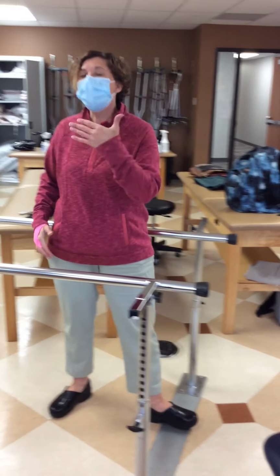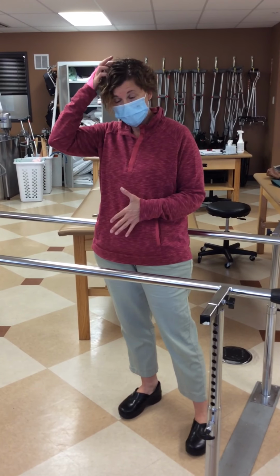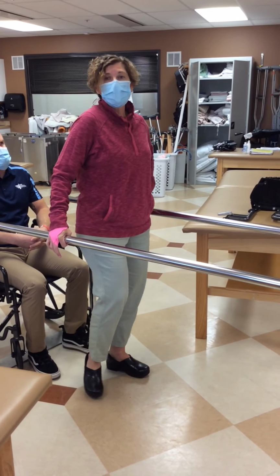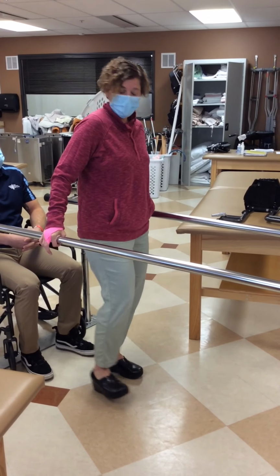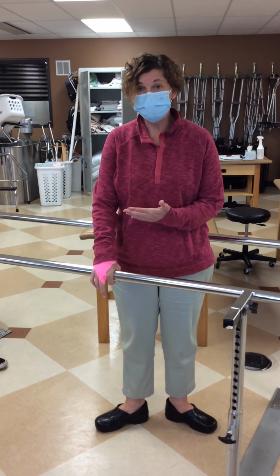So you can give them targets or talk them through with tactile cueing to increase the duration of time that they are weight bearing on that affected side, okay? To equalize those steps. All right, thank you.